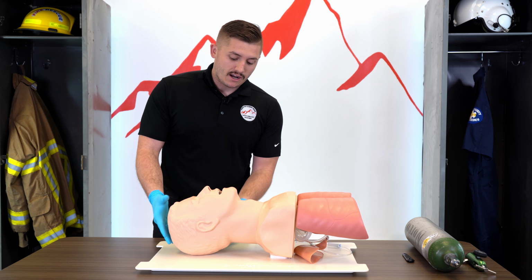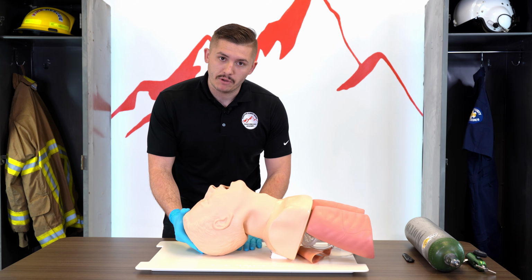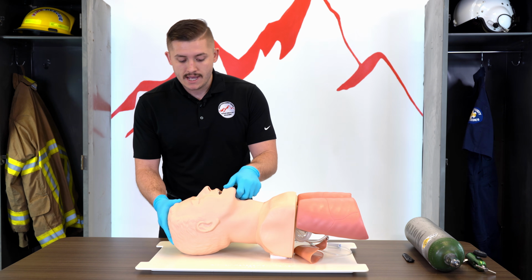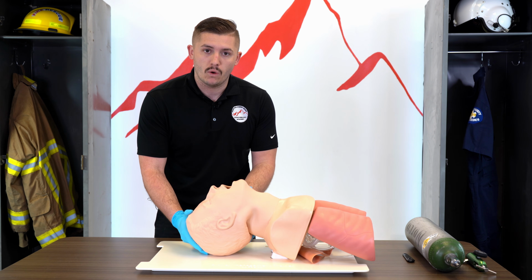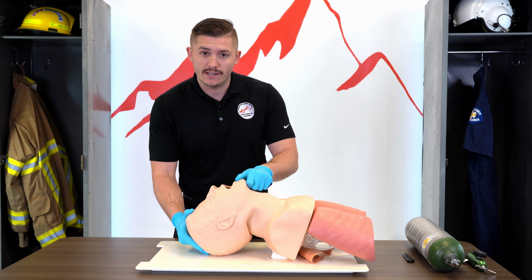With these mannequins, it's obviously a little bit easier as they are rubber and they grip to the plastic. On some patients, with hair or sweat or moisture, hardwood floors, things like that, this might be a little more difficult to maintain, so I might have to sit here and hold it. But yep, just one more time, head tilt, chin lift.